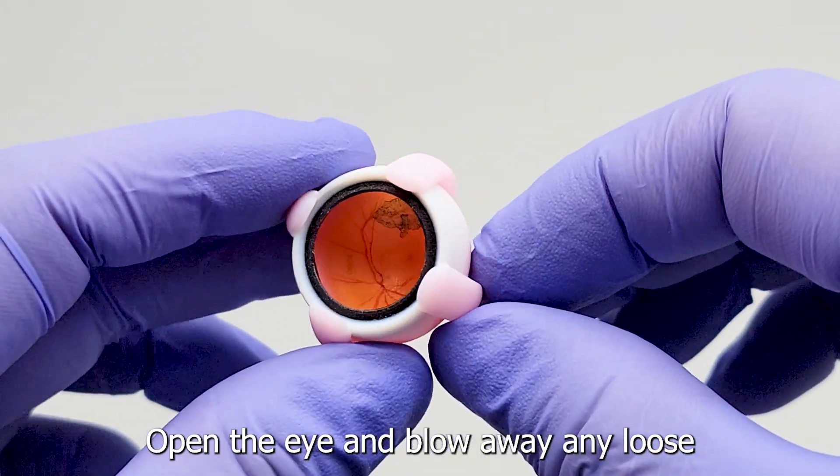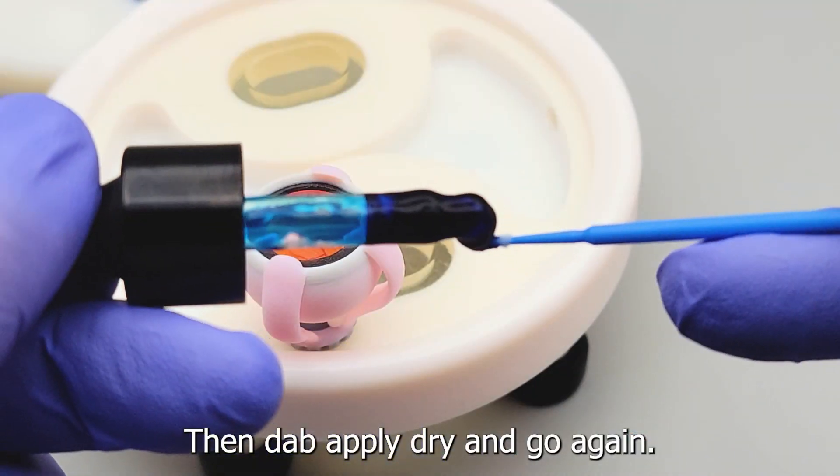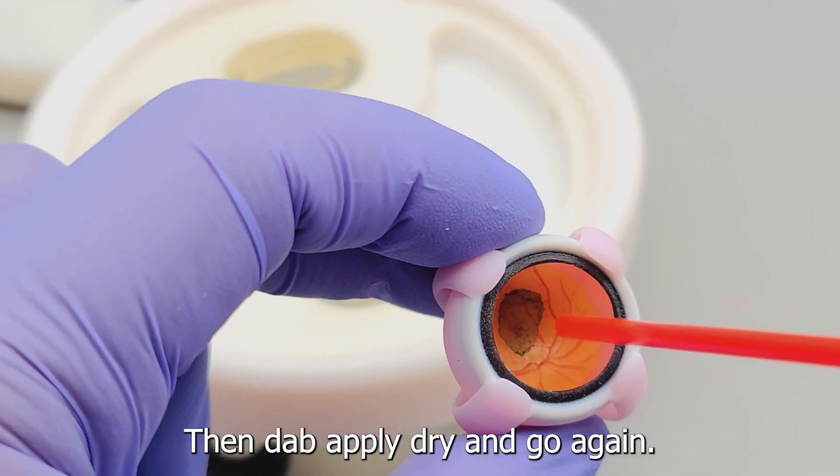Open the eye and blow away any loose membrane fragments. Then dab, apply, dry, and go again.